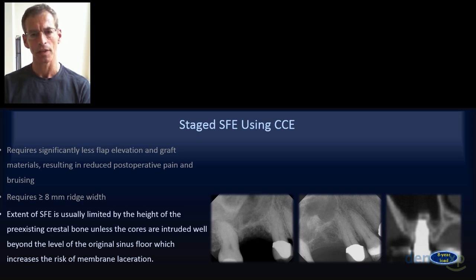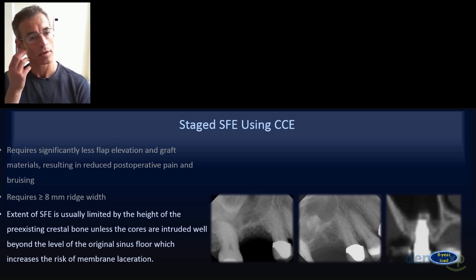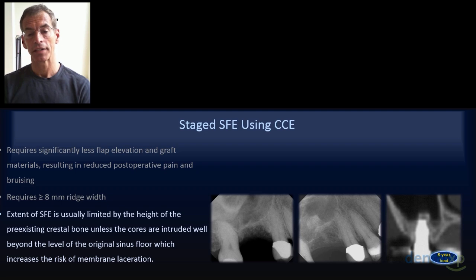laceration. This is a procedure that I don't use very often now, but used it when I first started out because I was not as comfortable with a lateral approach. I do find it very helpful at single tooth sites where there are adjacent teeth, where membrane elevation is more difficult and risky, elevating off of the adjacent roots, and also in the elderly patient who is looking for a more conservative approach.